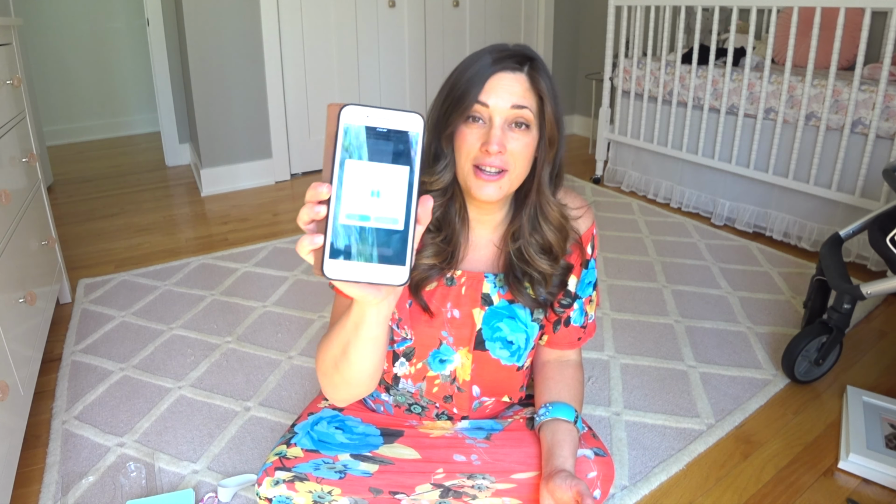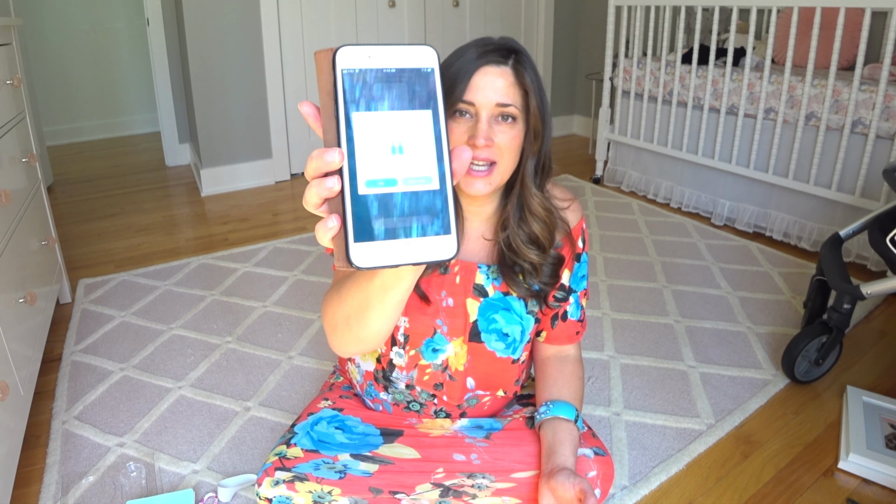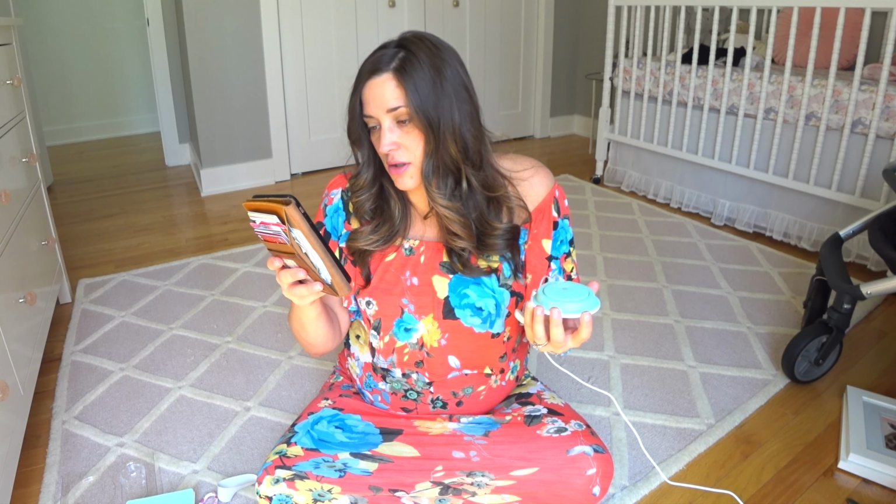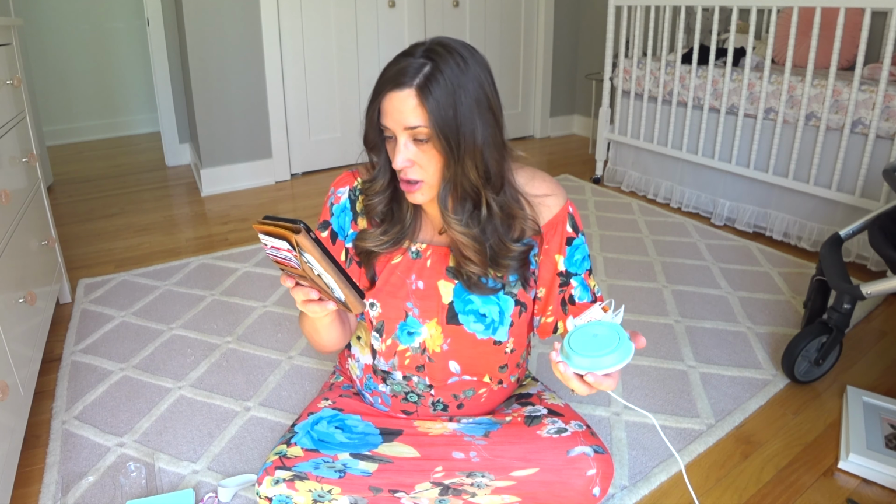It says, whoa, not so hasty. If the Wi-Fi light is shining on your base station, then you can really skip this. And it says really skip. So I'm going to press really skip. Register base station. There's a small button on the bottom of the base station. Press this button once. So it's this one right here in the middle. It says tap register to confirm. Register. Great job. It's now registered.